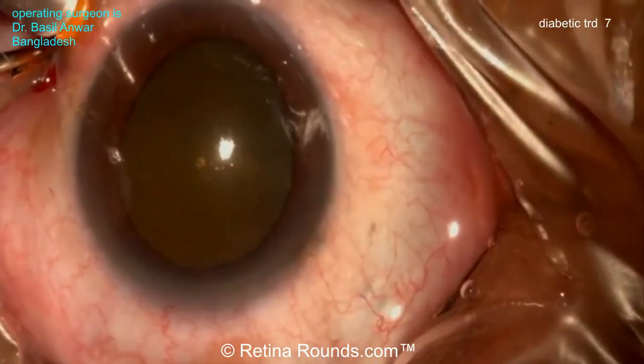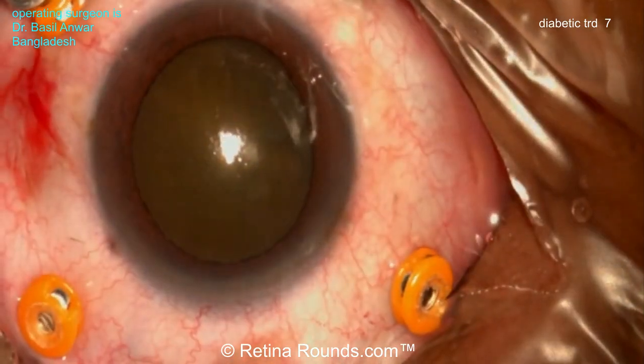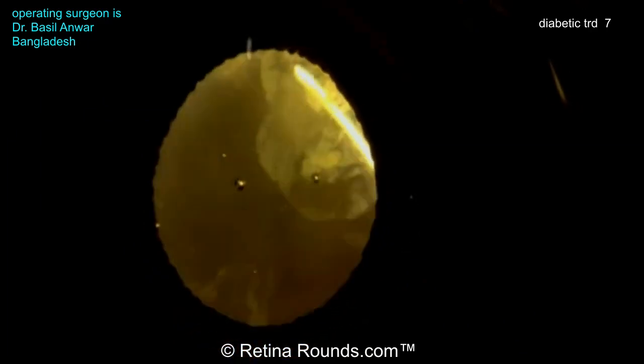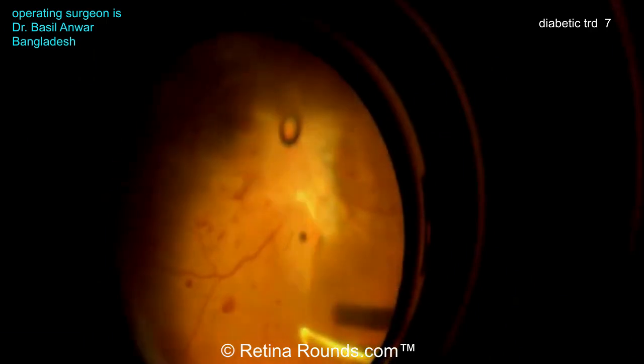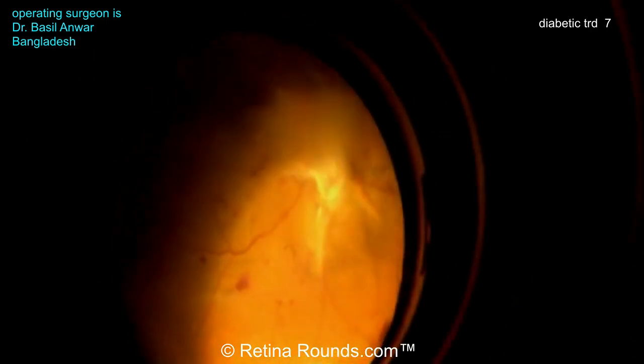Let's go ahead and jump right into Dr. Anwar's case. It looks like here he's using a 23-gauge setup for his vitrectomy, and starting with an anterior vitrectomy. Sometimes the anterior vitreous hemorrhage can be very severe, and cleaning up that view is obviously important to be able to continue with the case. This patient has a cataract, so it's certainly reasonable in some cases to even do cataract surgery with a lens implantation to really clean up the anterior vitreous hemorrhage.